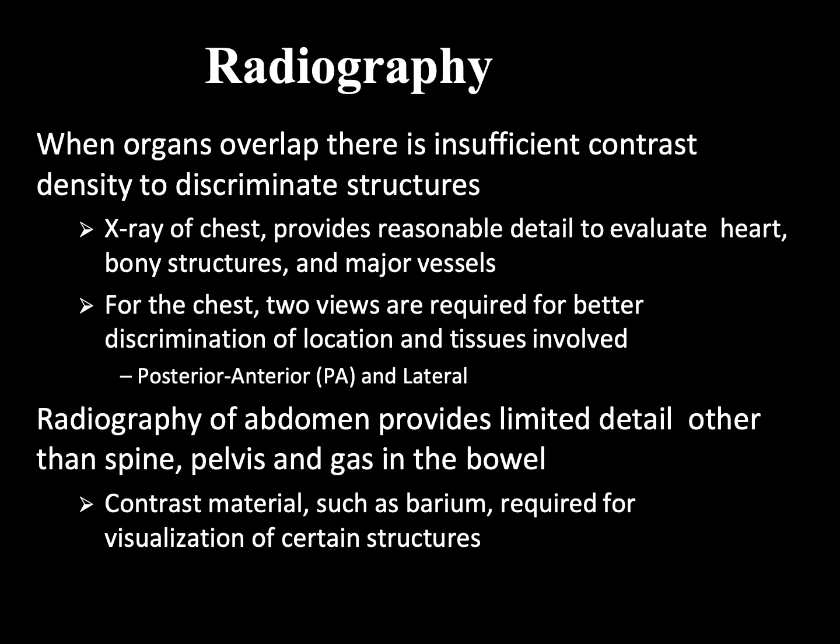Radiography of the abdomen usually doesn't provide as much detail other than spine, pelvis, and gas in the bowels. So in those cases, we use a lot of contrast material, barium, those types of things, to really be able to visualize these structures in the abdomen.